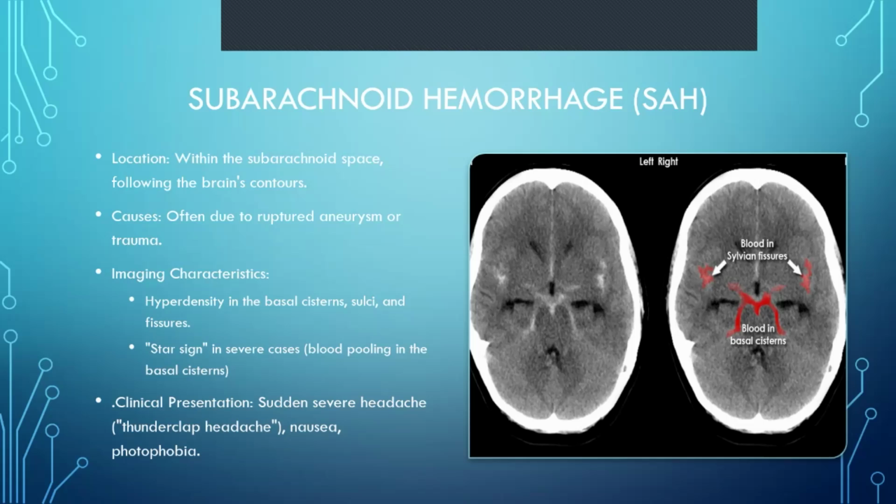And just so that she doesn't embarrass me too much, I'll say what I said at the start. This is just an introduction for juniors on how to read CT scans in the emergency department. But Dr. Moses, you're more than welcome to give us any sort of advice or anything. And if you want to say anything, just put it in the chat and I'll keep quiet, and you can tell us whatever else you would like to know.